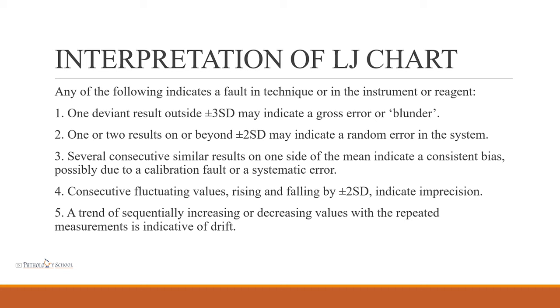To interpret LJ charts: if one value lies outside plus or minus 3 SD, it indicates a gross error or blunder. If one or two samples lie beyond plus or minus 2 SD, it may indicate random error and they are left as such. If several consecutive similar results lie on one side, they indicate a consistent bias, possibly due to calibration problems or systematic error. Consecutive fluctuating values rising and falling by plus or minus 2 SD indicate imprecision. A trend of sequentially increasing or decreasing values indicates drift.